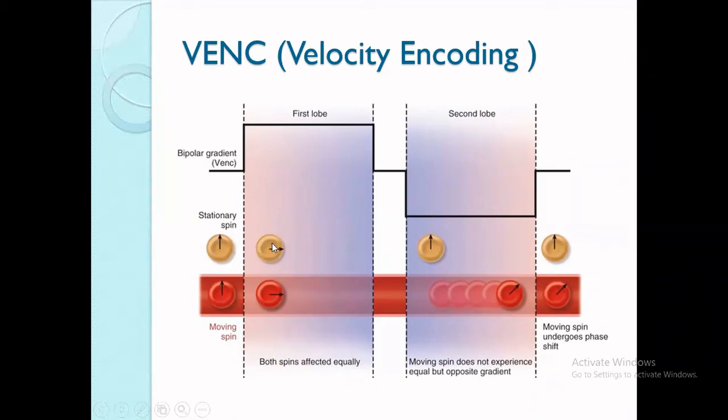This is the original position of the stationary one. But the moving one, following its path, will never recover to its original position. It will only slowly start to recover, because it's moving, so it will not carry the changes that were created by the stationary one. So have a look. The change will be only this much. It will return only to this point.